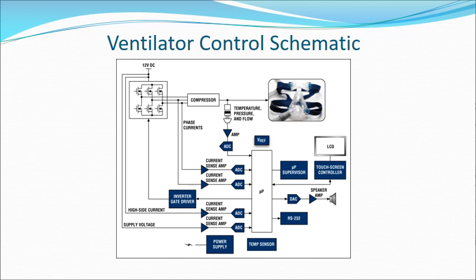So here's a typical ventilator control schematic where a compressor is controlled to produce controlled flow and pressure. It's a little different than our transport ventilators because the Pulmonetics version actually uses turbines, controlled speed turbines, to generate the inhalation path. And that adds a much finer degree of flow control and pressure by controlling the speed of a turbine.